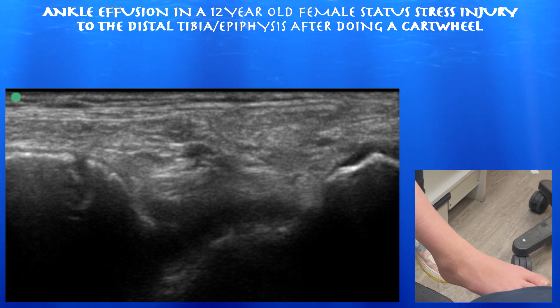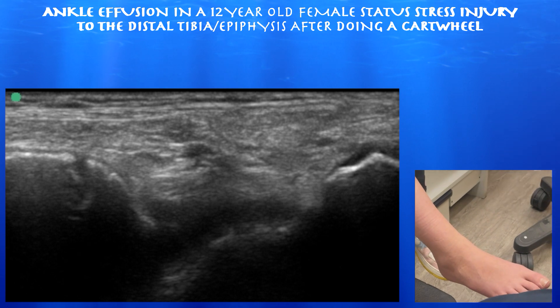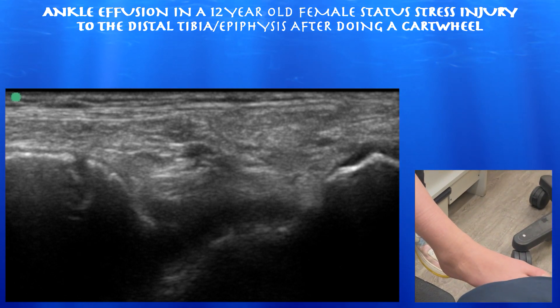She does have a moderate to large effusion, so we're going to look at her ankle joint today to assess the effusion. She's a gymnast interested in getting back into competition, and this may help assess and guide how her recovery is going.